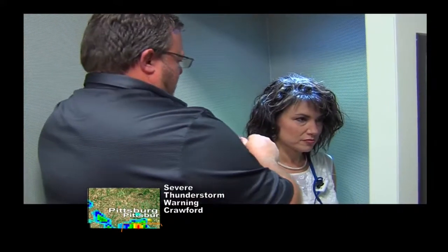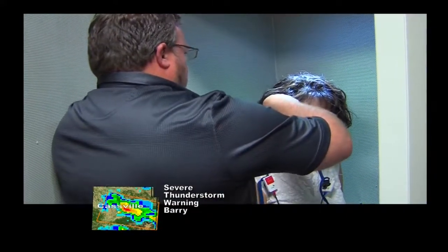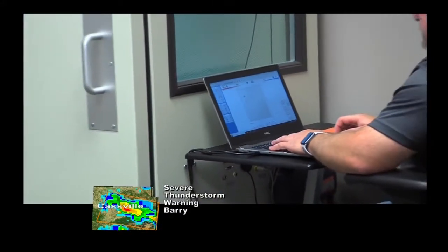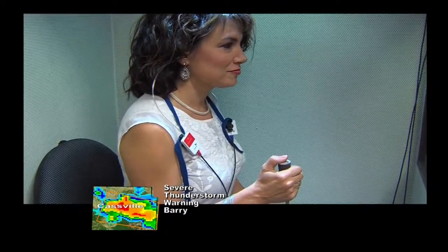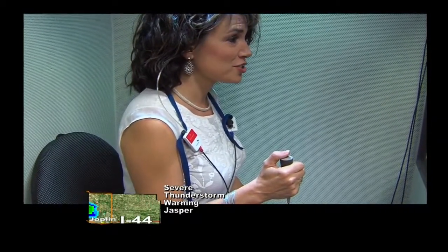Look, I'm getting all hooked up there. Yep. I don't know what all I've got on there. What's on top of my head? So those are insert headphones we do the actual hearing test with. So there you are. And they're getting ready to hit the button. Yep. So when I hear the sound, I hit the button.